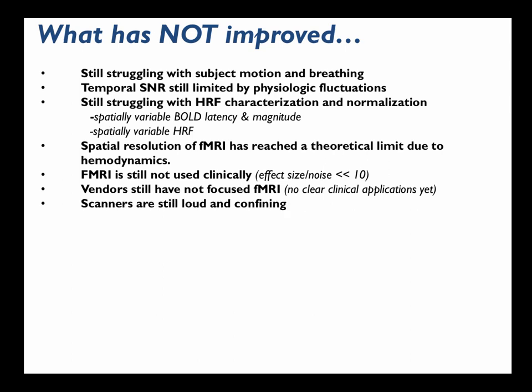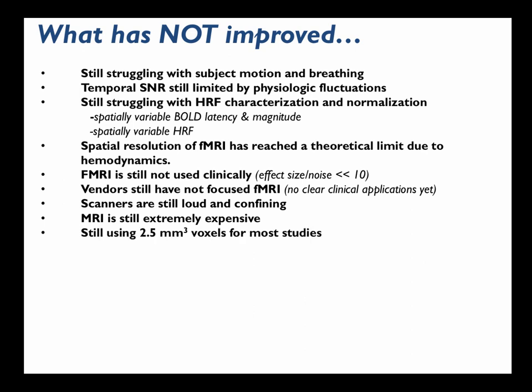Scanners are still loud and confining. MRI is still very expensive, even with all that success. We're still using 2.5 millimeter voxels for most studies, which we can do better.